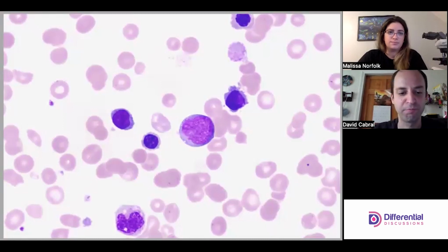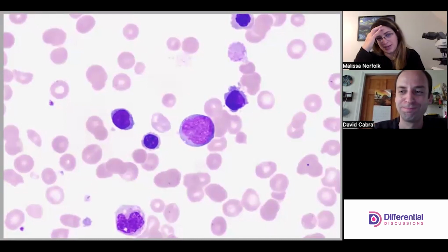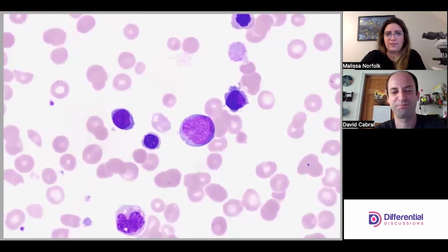Absolutely. I would groan every time I did this stuff. It's not going to get easier. No, it doesn't. How many years have we been looking at this slide and we're still like, ugh. So it's a challenge, but I think that's all we have for this slide.